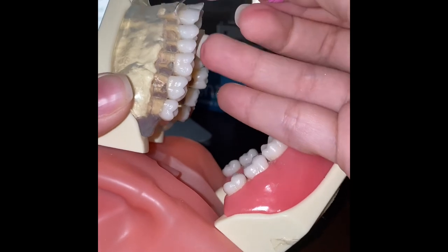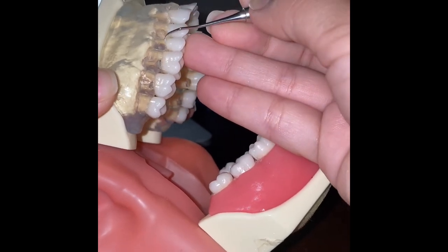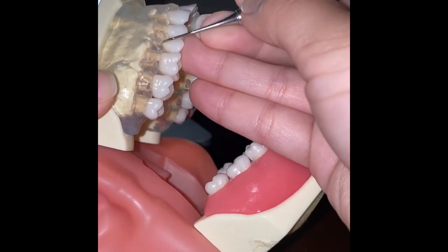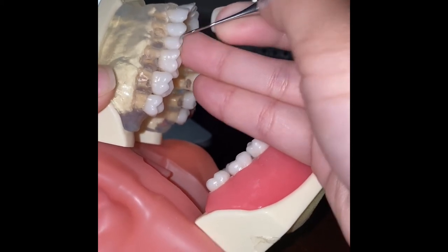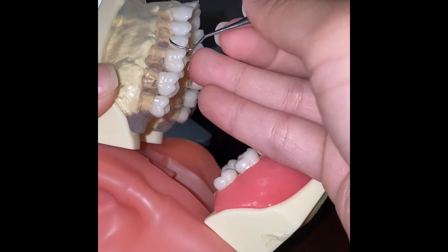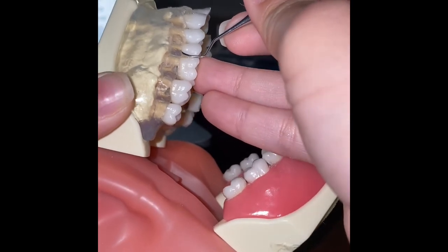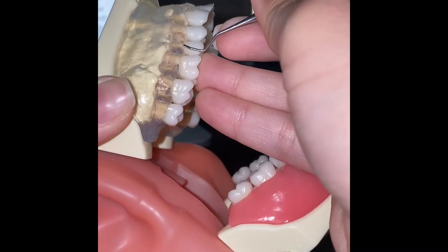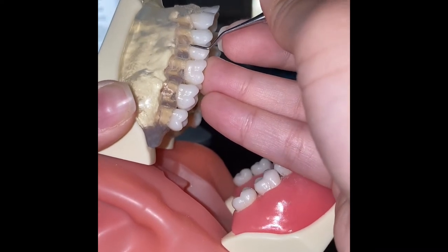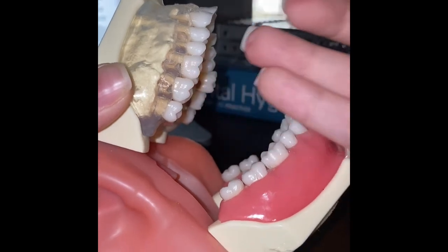Then we move to the next tooth and work mesially.